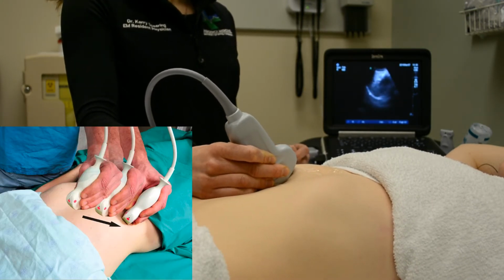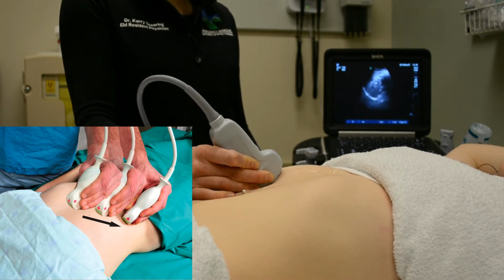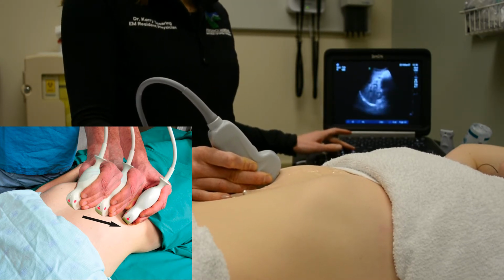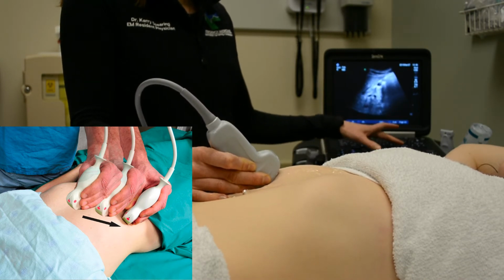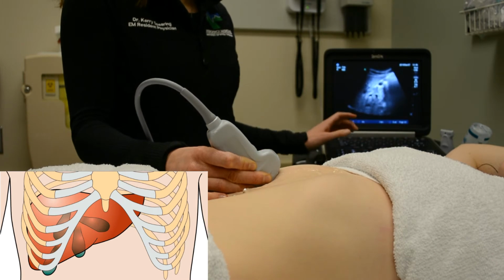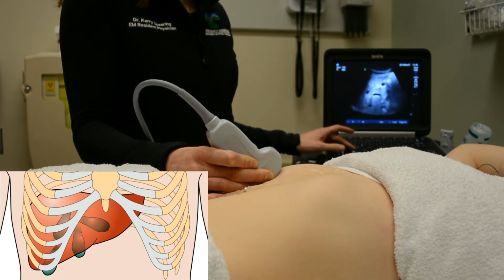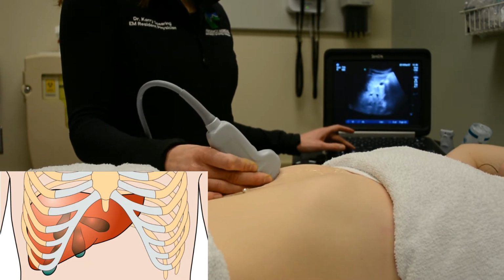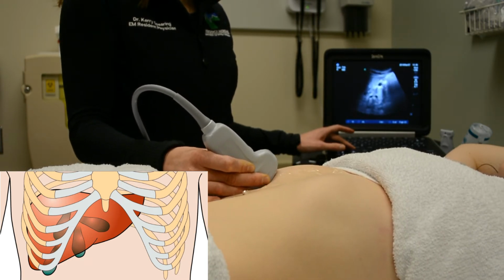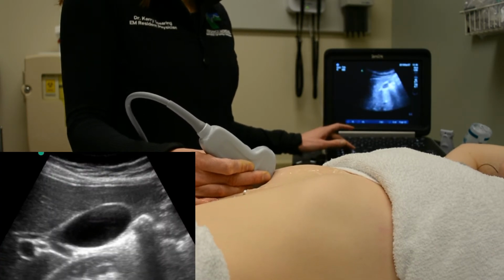Slide the probe along the right costal margin from the epigastrium to the anterior axillary line. Keep the liver in view by adjusting your depth and degree to which you're heeling the probe cephalad. The gallbladder is usually located close to the midclavicular line at the costal margin. However, it can appear anywhere between the epigastrium and the anterior axillary line. Look for a cystic structure.